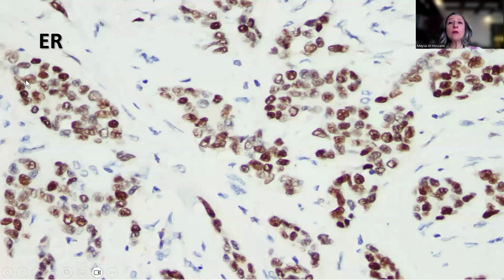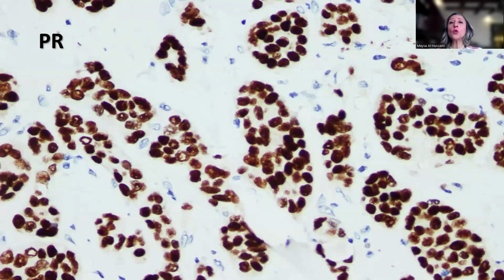Now, ER would be very helpful in this context because invasive, especially the low-grade invasive ductal carcinomas, are usually strongly diffusely positive with the ER. Remember that this is not the case with benign lesions in the breast, where we tend to see the mosaic staining pattern. PR also is strongly positive, and this pattern of ER and PR positivity would strongly support that these glands, although they label the cells themselves with P63, are malignant and not benign glands.